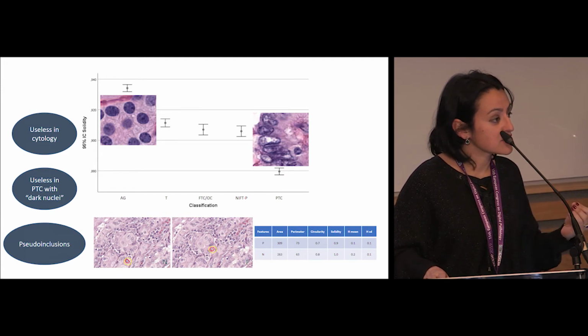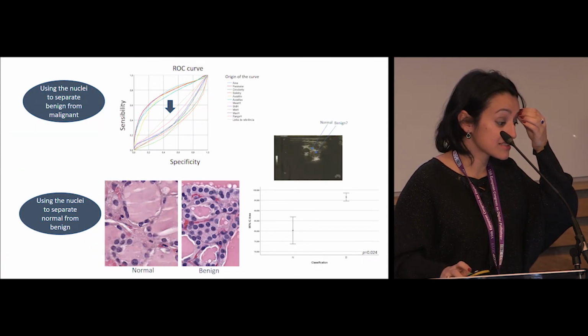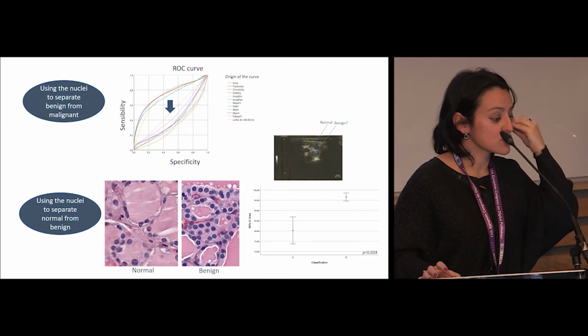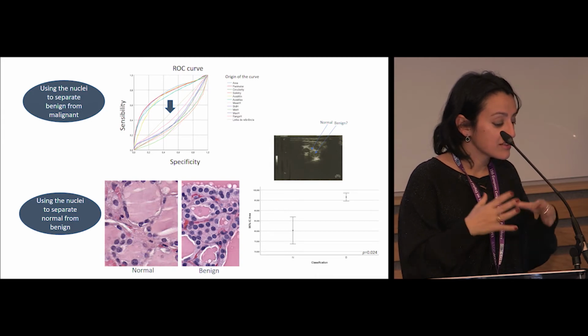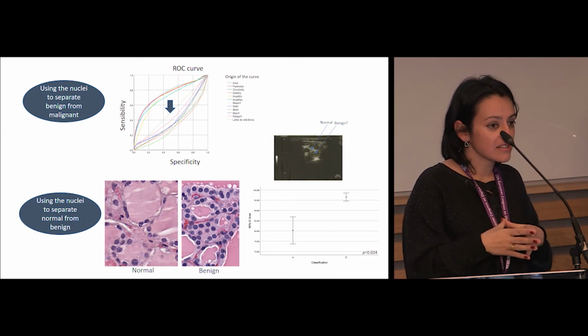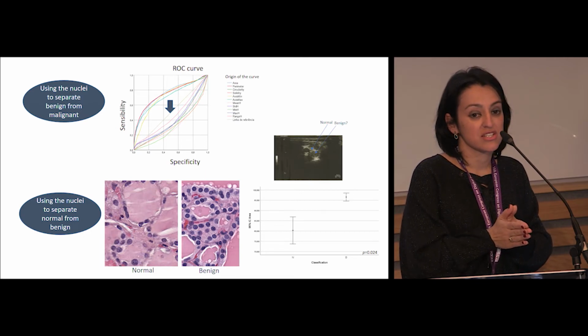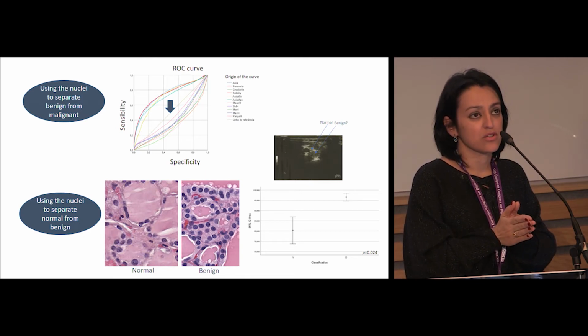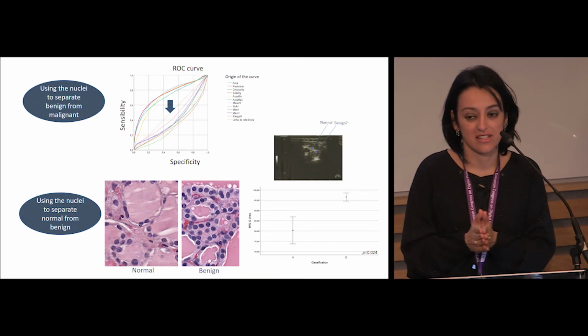And in the setting of histology, it's not important, but in cytology, it is. The results that we found here look very promising. Using the nuclei to separate benign from malignant can have real value in grading the nuclei, and in optimal conditions can be contributive to do this grading. I would like to add another thing here.